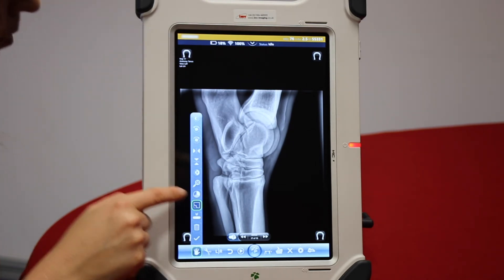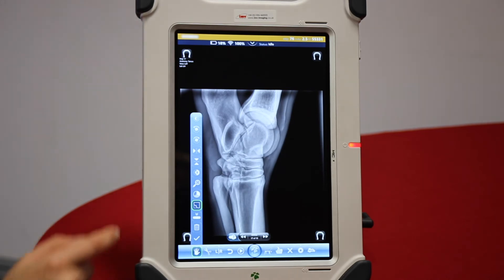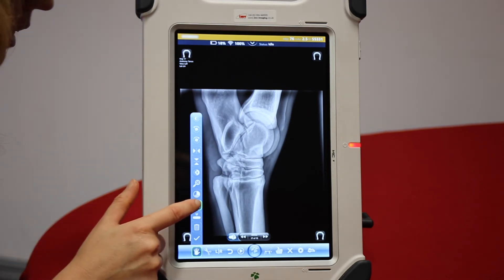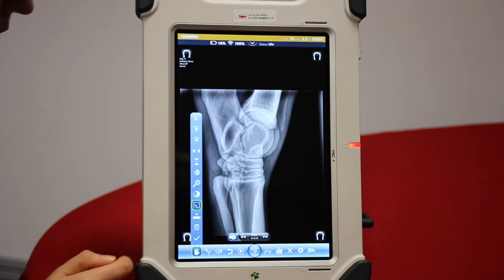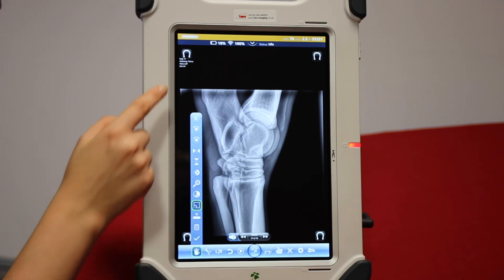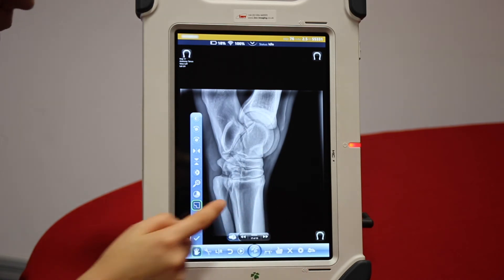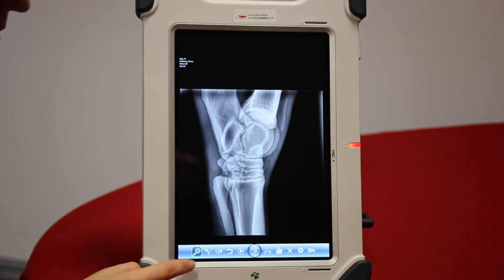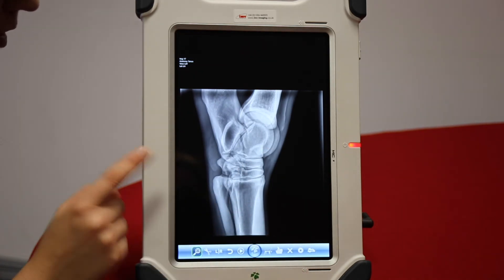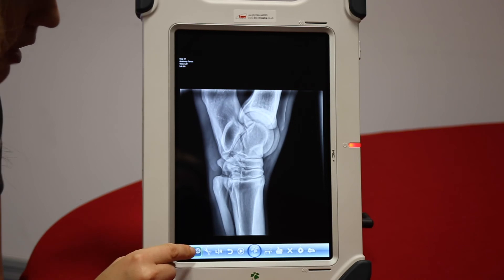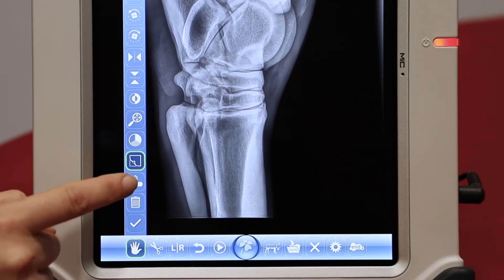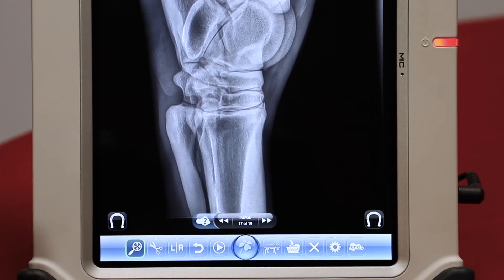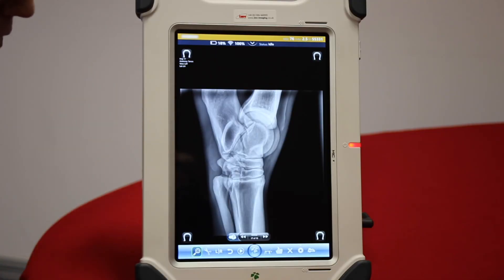The notepad icon controls whether you display or hide the text overlay. The paracetamol tablet icon controls whether you show the text and hoof prints or hide the whole thing. This is very useful to see the image clearly, but when you need to take another image, you need to bring this back up so you can pick your next view.